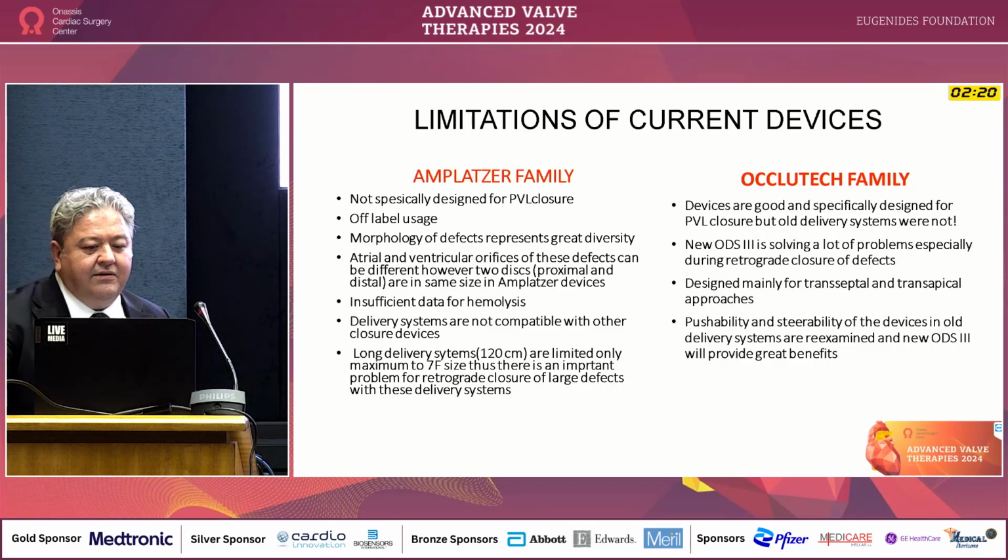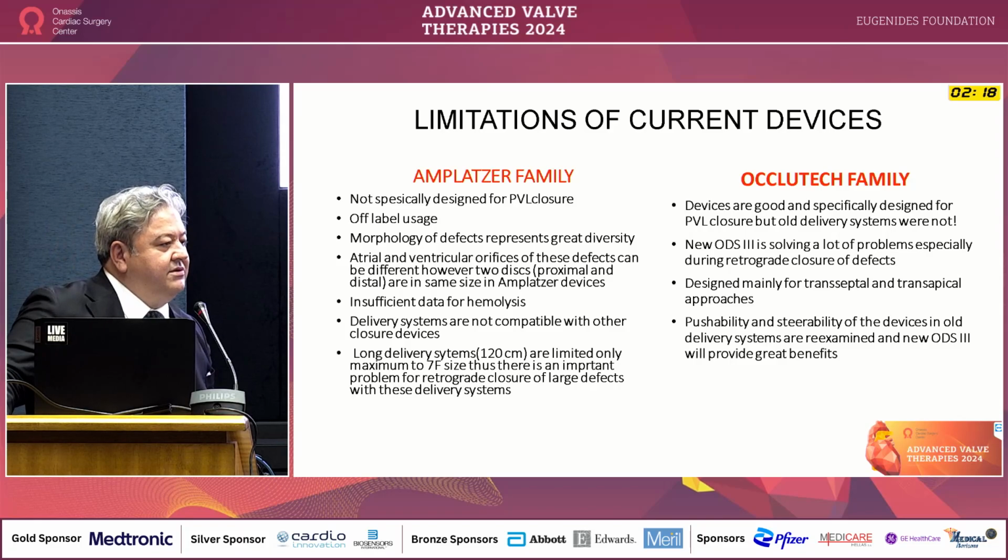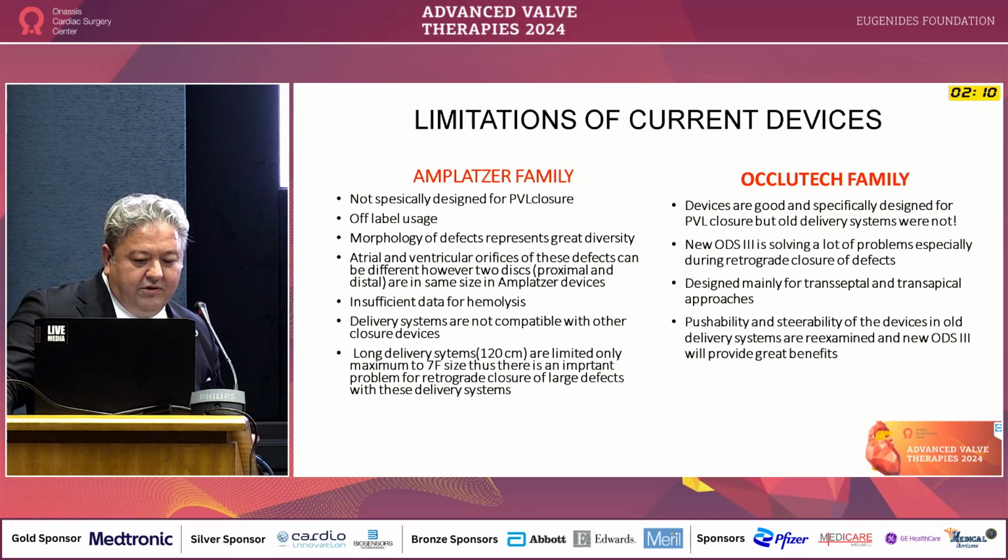So there are still limitations of current devices. The Amplatzer family is not specifically designed for paravalvular leak closure. It is off-label usage, the morphology of defects represents great diversity, and the atrial and ventricular orifices of these defects can be different.